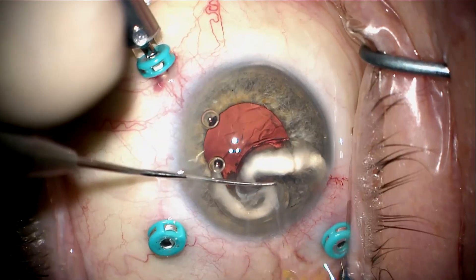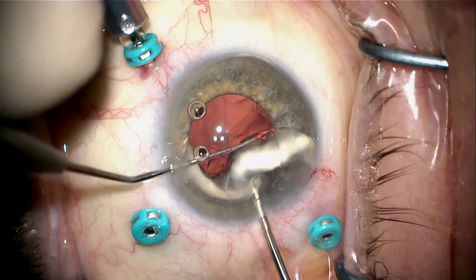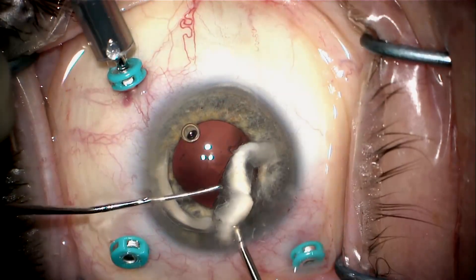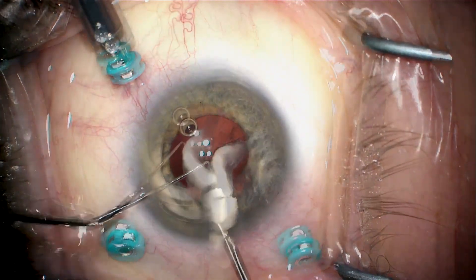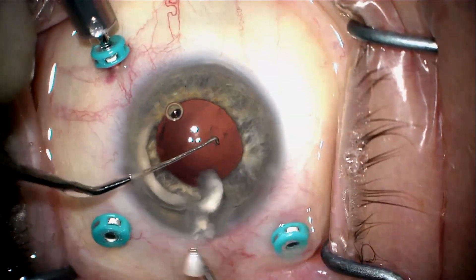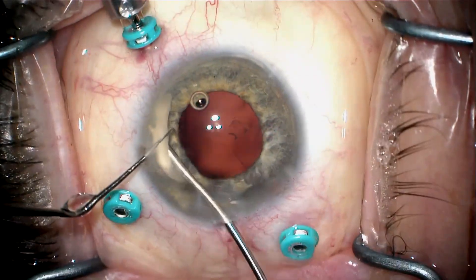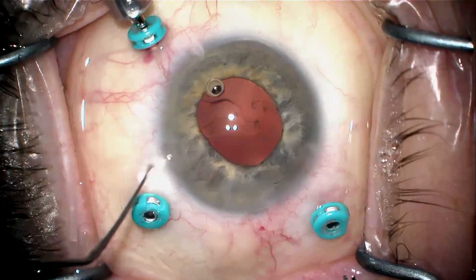I've turned the infusion back on. Now I want to trap these capsular tension ring segments and force them out through my incision — I don't want them to fall back. I'm going to be very careful manipulating them so that infusion pressure guides them out the main incision. I've raised my infusion pressure significantly to force these fragments out, and you'll see me guide this last piece so its tip enters the incision and it comes right out.